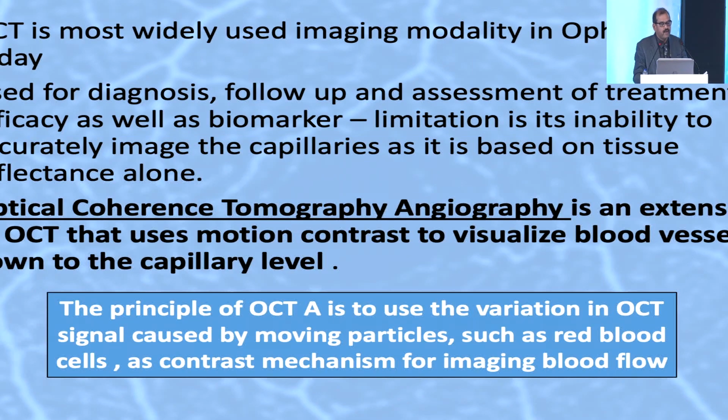OCT is the most widely used imaging modality in ophthalmology today. It is used for diagnosis, follow-up, and assessment of treatment response, as well as a biomarker in retinal practice. Limitation of OCT is in its inability to accurately image the capillaries, as it is based only on tissue reflectance.